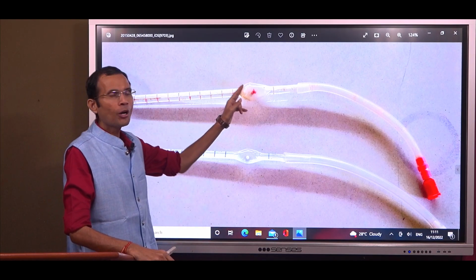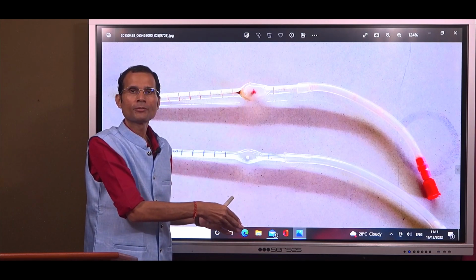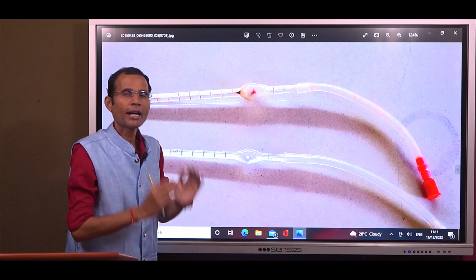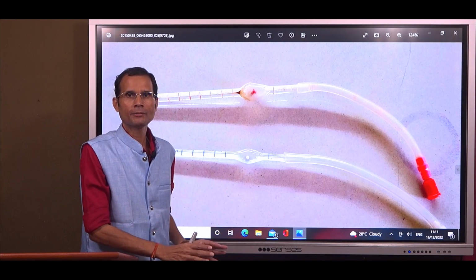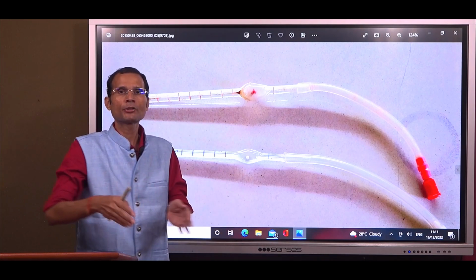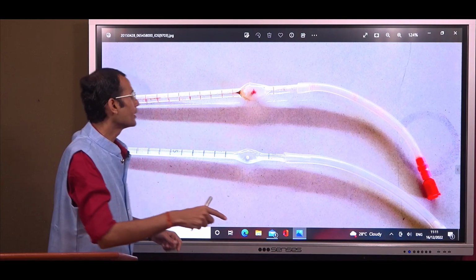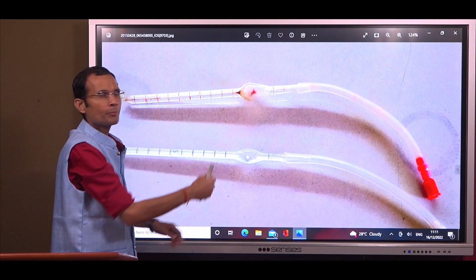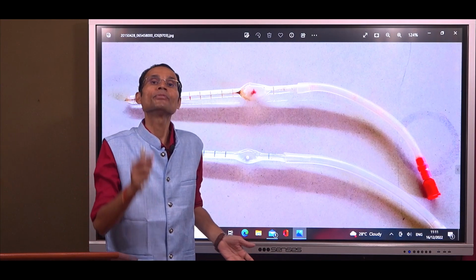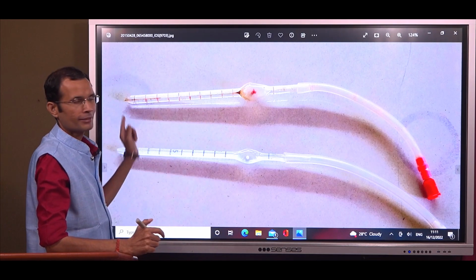0.5 was diluted to 100 because dilution is taking place within the bulb, and the capacity of the bulb was 100, out of which 0.5 parts were blood. Therefore 0.5 was diluted to 100. That means 1 is diluted to 200 times dilution. And because the entire blood sample was mixed in the bulb and this portion will contain only the diluting fluid, you discard these first 2 drops from the stem.